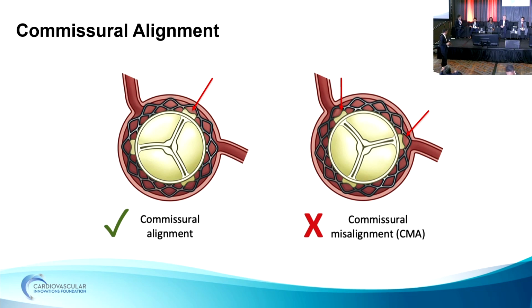Okay, and then if this happens to you, I know it's a differential, is it the cusp or not, but people are not very experienced, right? Is this the right time to make a differential, or should you be moving to something quickly? Obviously, you tell us about the story, but do you call for help at this point? Do you call the surgeons to open the chest? How many people would call the surgeon to move on?